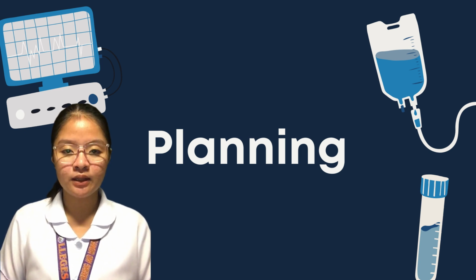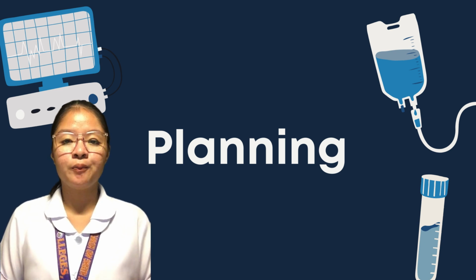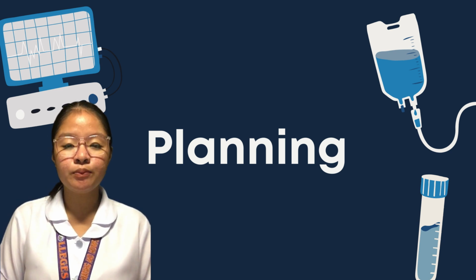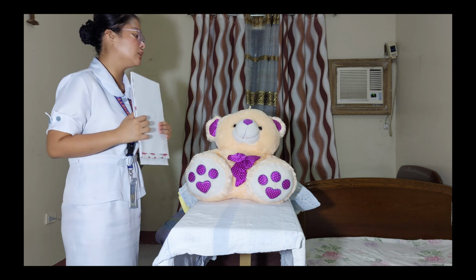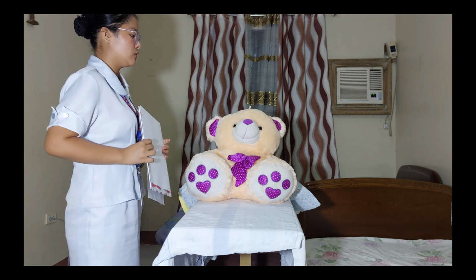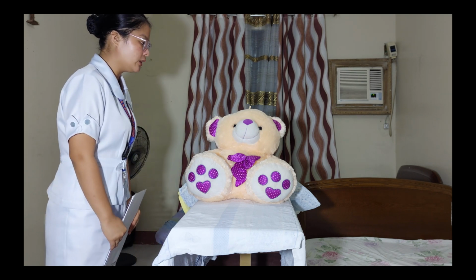Preparing the environment will give the patient privacy to be comfortable during the procedure. We can give our patient privacy by closing the door and curtains and locking the door. Kailangan isasarado ko po yung pinto and yung cortina para walang makapasok dito sa kwarto. So, tayong dalawa lang po yung nandito. Okay lang po ba yun?